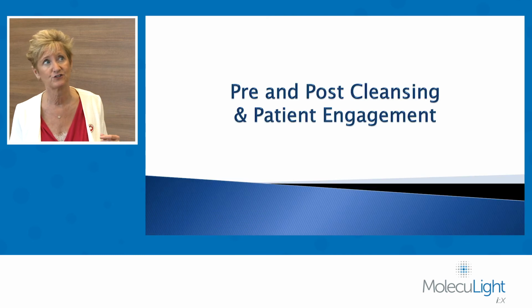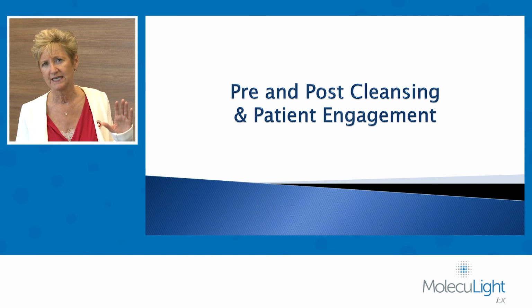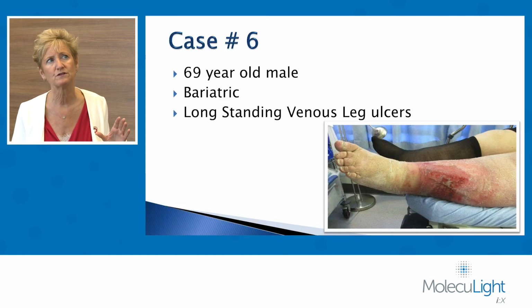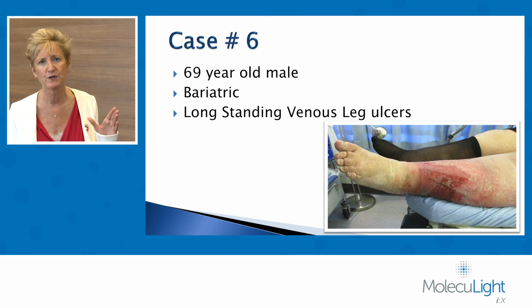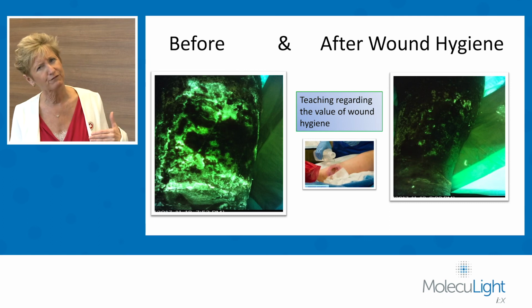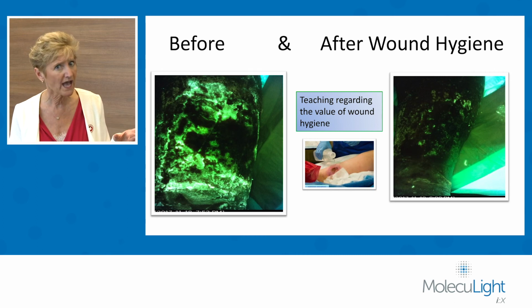Let's just talk very quickly also about the pre and post cleansing and the patient engagement that can happen. So this was a gentleman who was bariatric, but he had long-standing venous leg ulcers. So again, when he came to clinic, he had a fair bit of Pseudomonas, and that's demonstrated as a cyan color with the MolecuLight. So it's not the red, but it's a special cyan color.